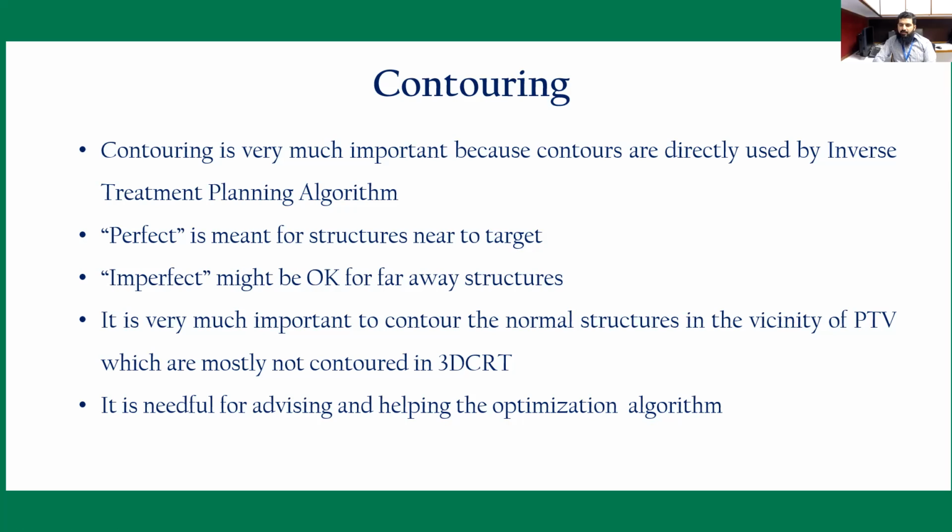It will be very helpful if we contour the organs beautifully for the optimization algorithm. If the doctors are here, they should be very careful regarding contouring if they are switching to VMAT or IMRT plans.